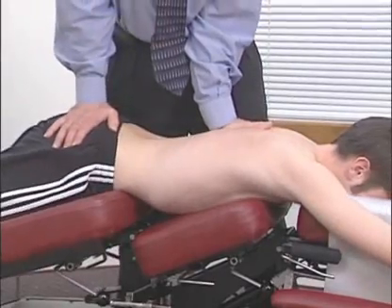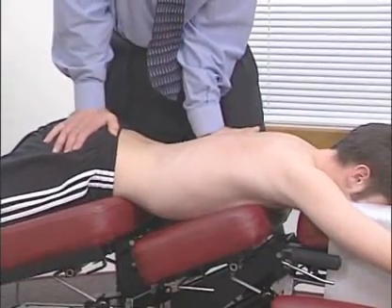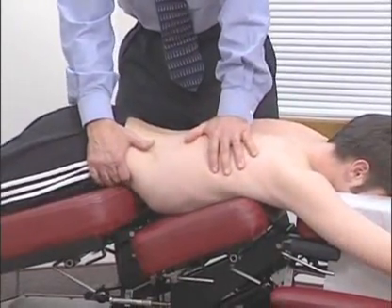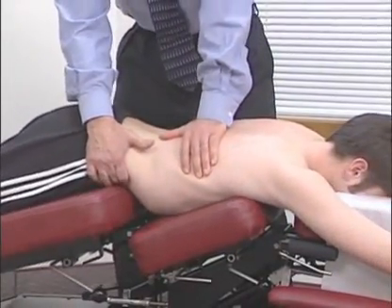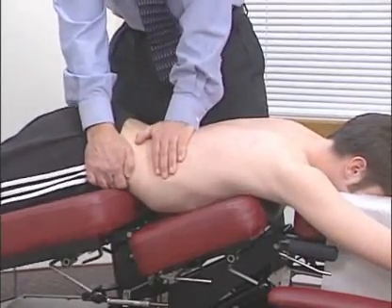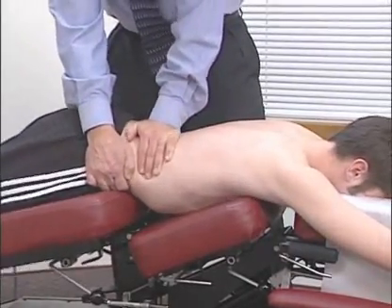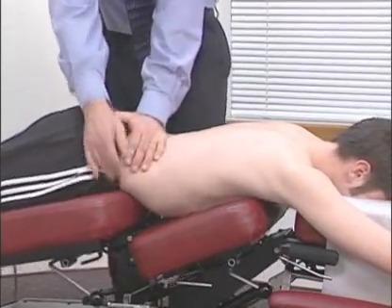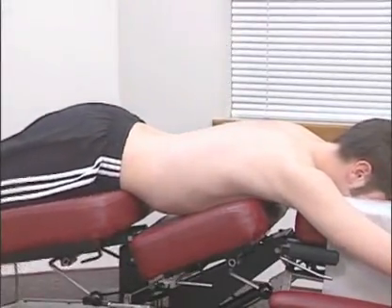Apply equal and gradual pressure with both hands. Pressure is applied only when the patient's feet have started in a downward motion. Decrease pressure when the patient's feet have started in an upward motion. Remember, this is a stretch, not a spinal adjustment. Be careful not to dig or thrust into the muscles or joints. Keep in mind the patient's comfort.